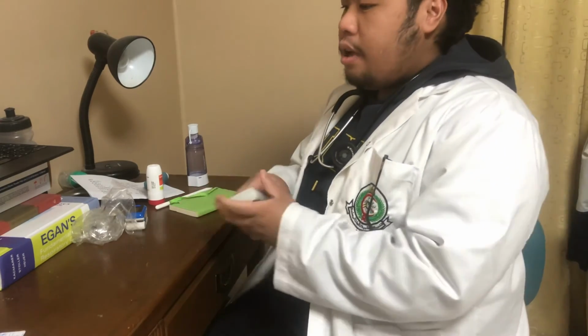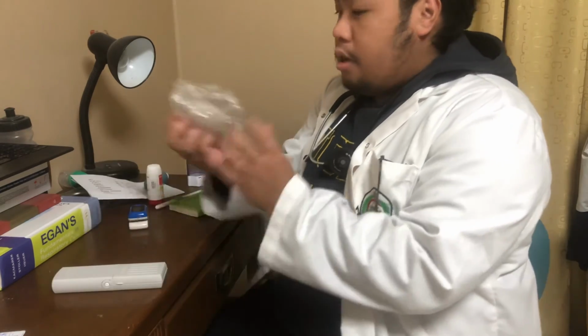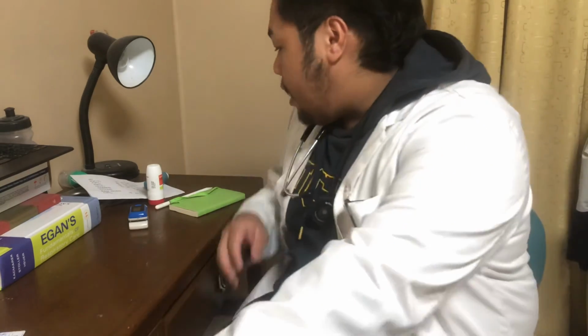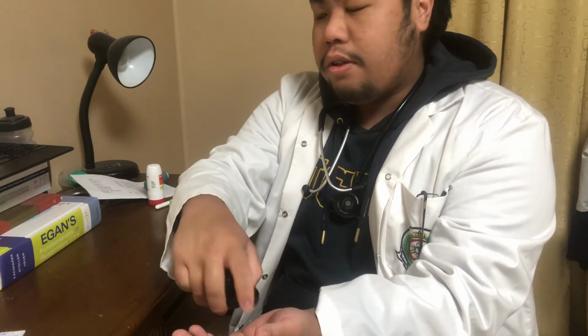After thanking the patient for their cooperation, we should always do the final step in our RD, which is aftercare. Make sure to clean every single part of your area to make sure that there isn't any contamination and to avoid any infection. Make sure that the sterilized parts are in their places. After that, make sure to wash your hands. Performing hand wash will keep you safe from any contamination and other infection towards other patients and the safety of the public.